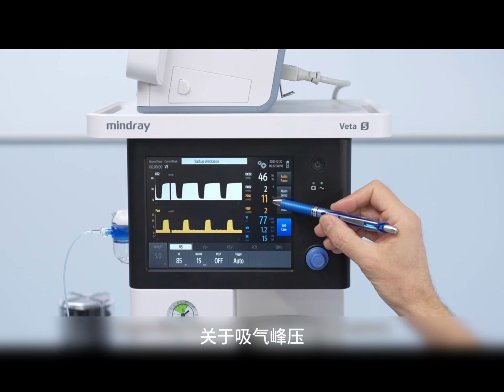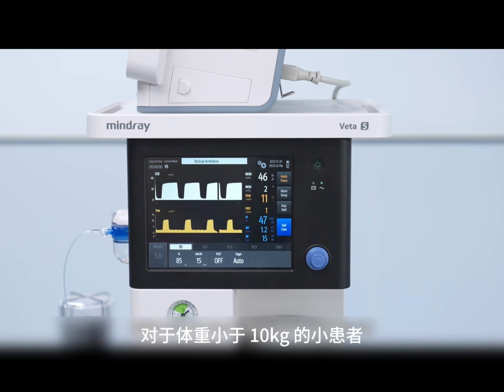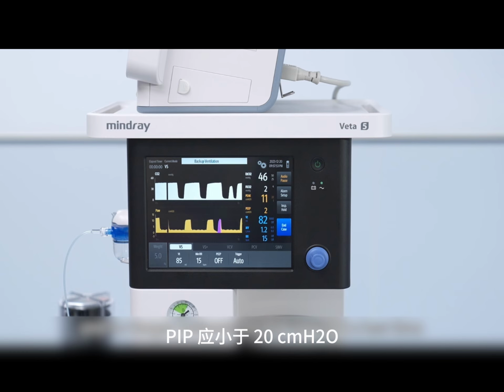Regarding the peak inspiratory pressure, the rough guideline is that the PIP should not exceed 10 centimeters of water in smaller patients, let's say under 10 kg of body weight. And for larger patients, the PIP should be less than 20 centimeters of water.